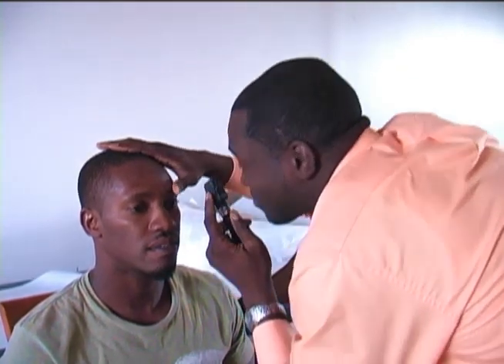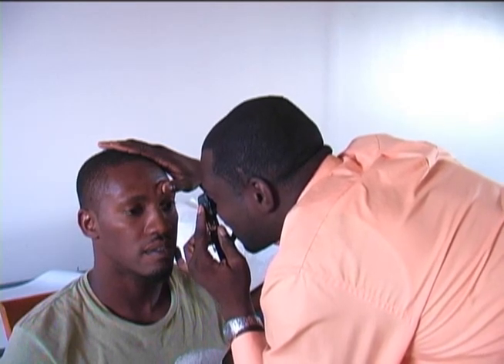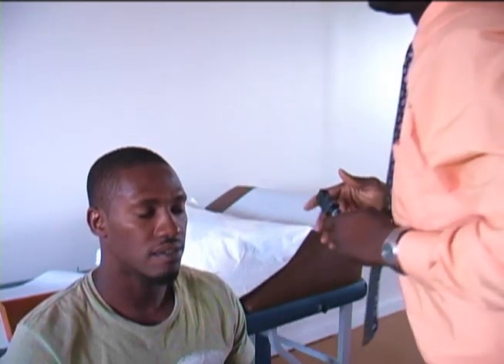You've got to go in till your hand touches. Normal fundus should be free of hemorrhage. Any yellow, white, gray, or black interruptions of the background retina are abnormal and suggest exudates. This completes the examination of the eye.